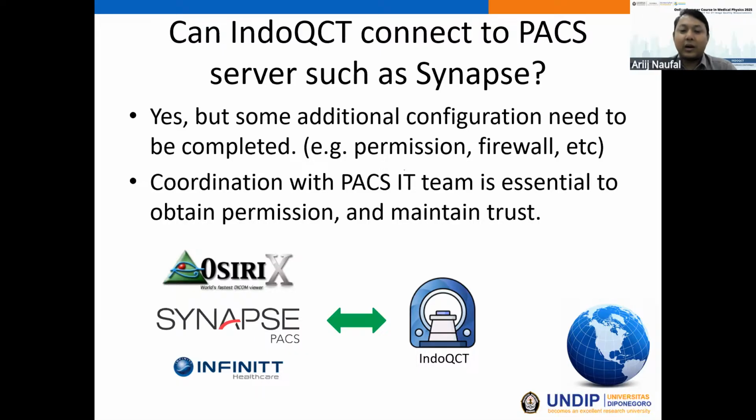Because of the risk of sensitive information leaking to outsiders, the PACS configuration is usually strict. So we have to coordinate with the admin or the IT team of the PACS system installed in our facility to obtain permission for our software, in this case IndoQCT, to be recognized by the PACS, and conversely, the PACS system can be recognized by the client in the IndoQCT.